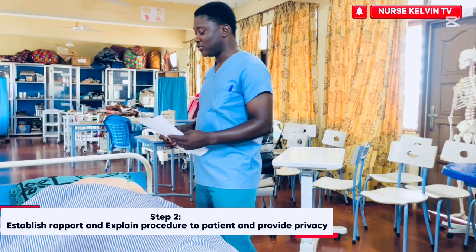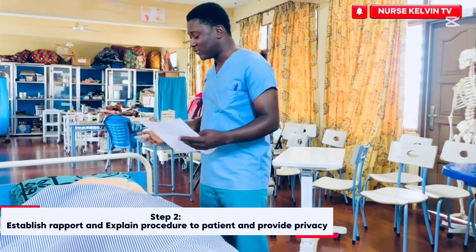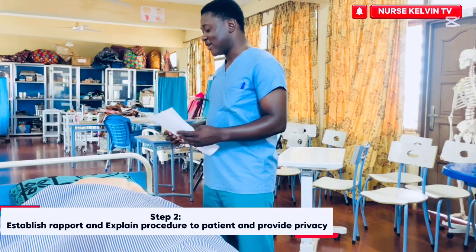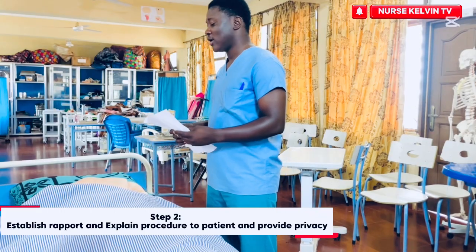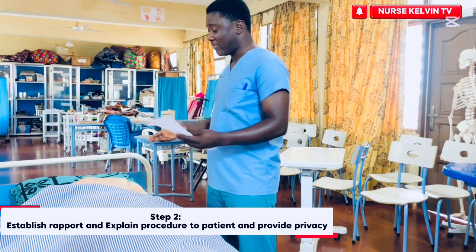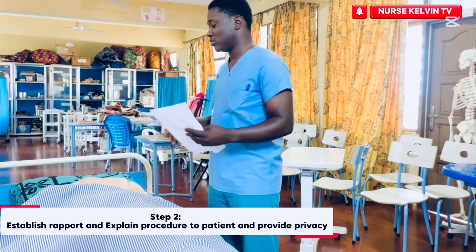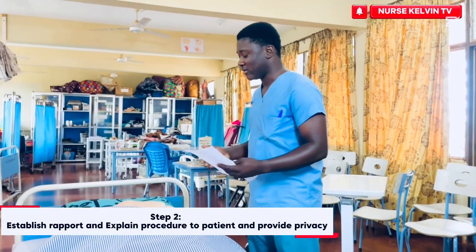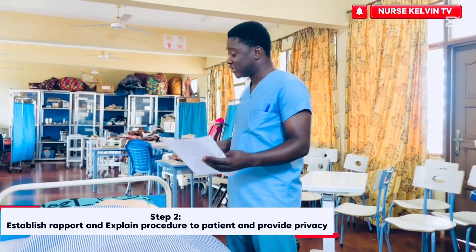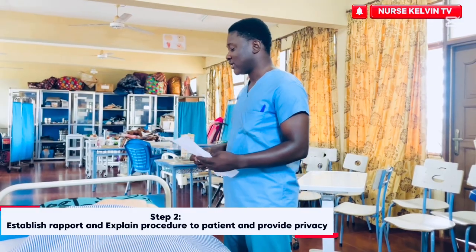And this medication, you are going to take it at your butt area. You are going to feel some pain a little, but you need to bear with me. Then also I'll be turning you a little. So please, am I permitted to bring my staff? You have the right to reject the medication, but due to the benefit of the medication, I'll be glad if you give me the permission to bring my staff to help you out.